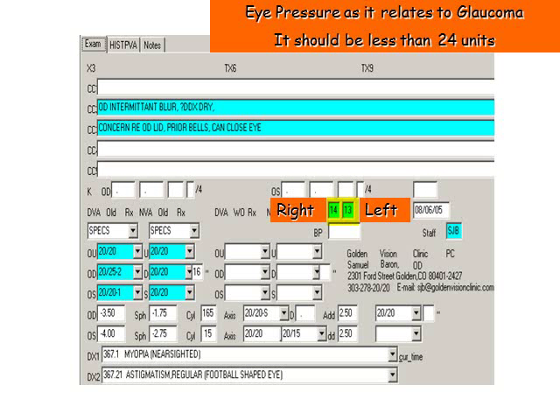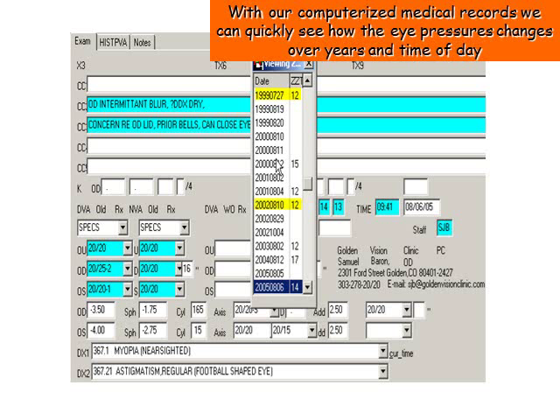Here we see eye pressure as it relates to glaucoma. It should be less than 24 units. With our computerized medical records, we can quickly see how the eye pressure changes over the years and time of day.